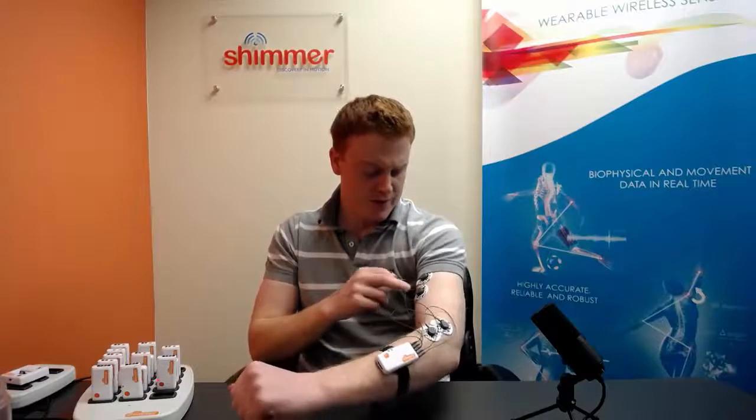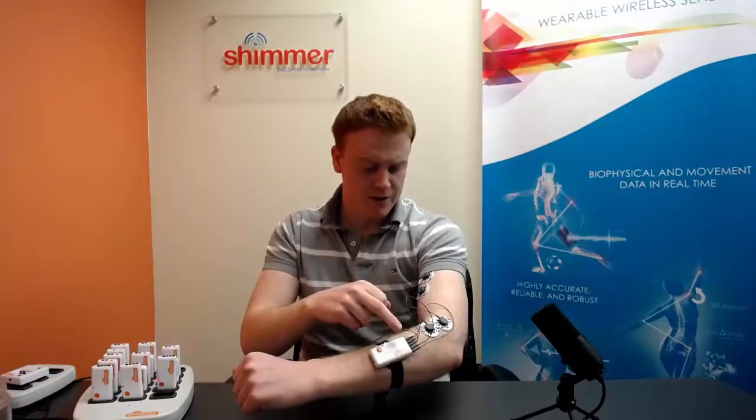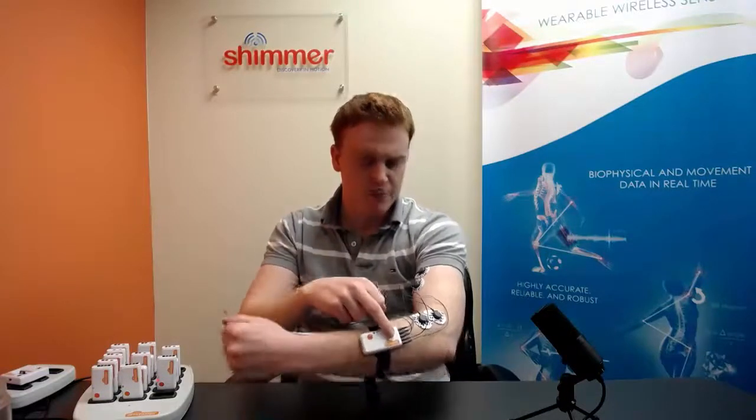So as you can now see, the leads and electrodes are connected to the Shimmer unit. It's also recommended to wipe down the measurement site with an electrode or with an alcohol swab before attaching the electrodes to ensure the best skin connection.